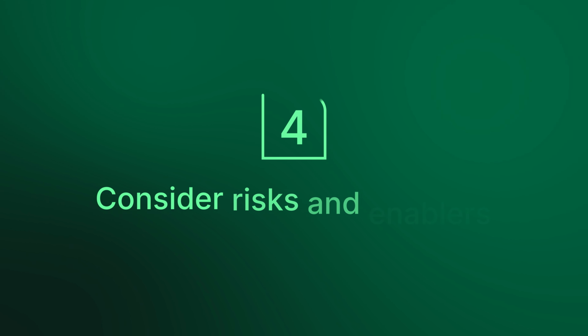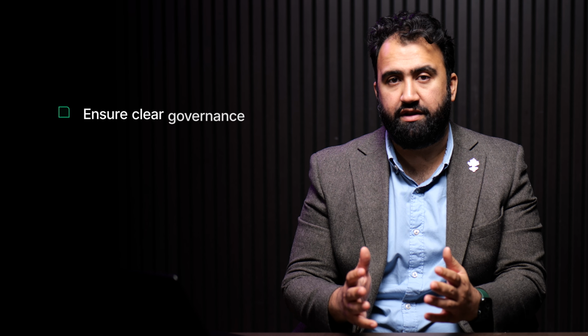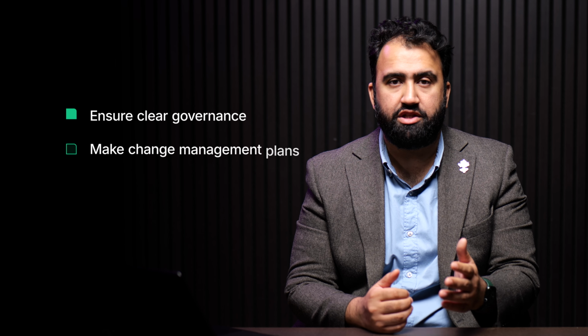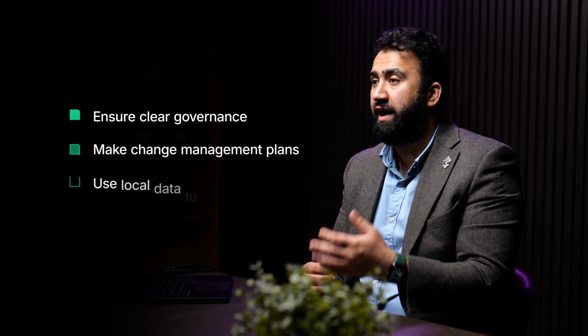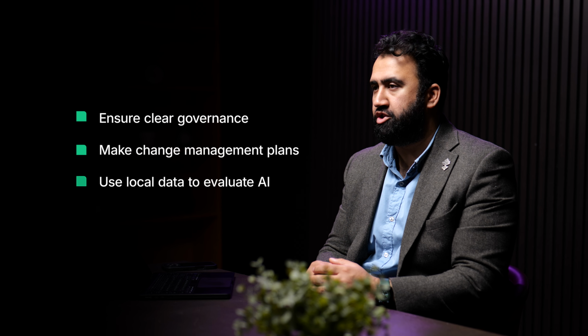A strong business case also considers risks and enablers. For example, you need clear governance for clinical safety. You also need change management plans to help clinicians adopt the technology. And you need to evaluate the AI using your local data to ensure it performs safely for your population.